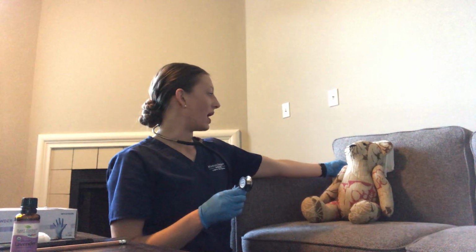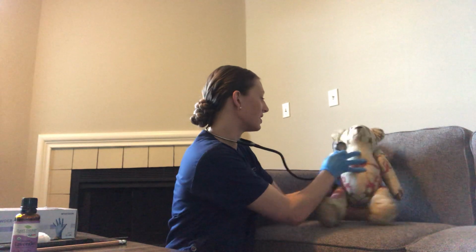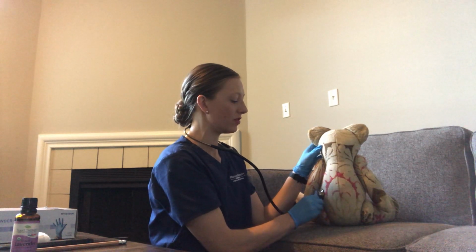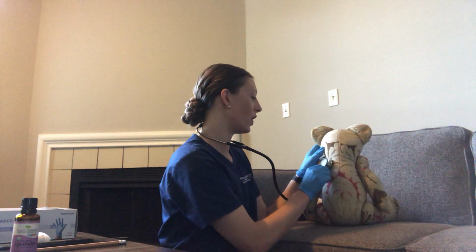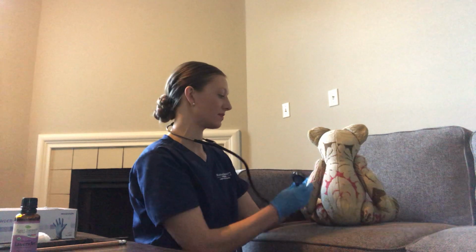And then I'd have him turn around or sit forward, and then I'd listen to his back. On the back, I'm listening to 9 areas. That's going to be down each side, and then I'm also going to move laterally. I'm spacing these about 5 centimeters apart on humans. So I'm listening over all lung tissue for an entire inspiration and expiration in each of these areas.